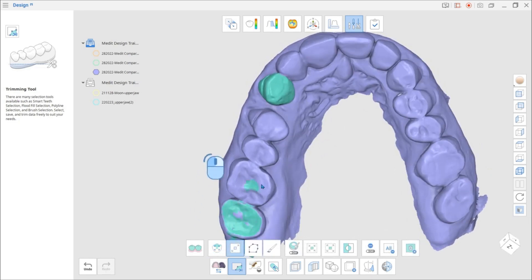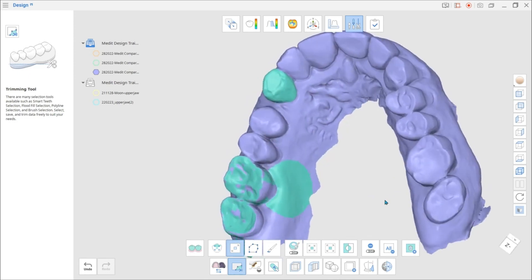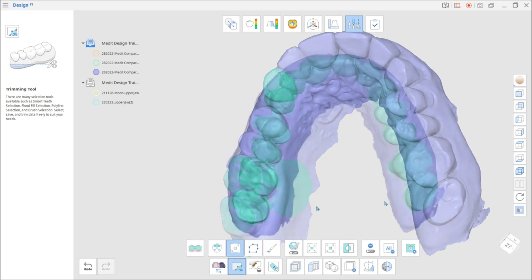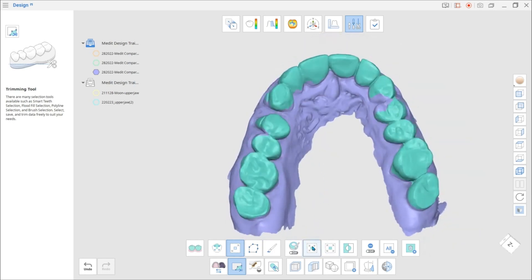The next selection option is the Flood Fill Selection. It fills and selects the area that is clicked and dragged over. You can move the mouse to expand or reduce the selection area.